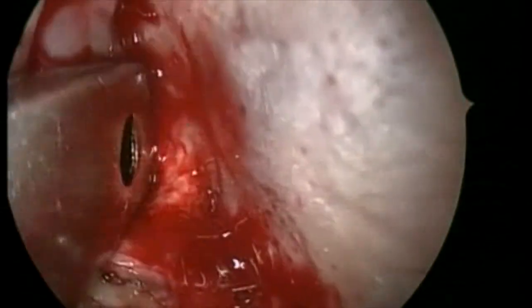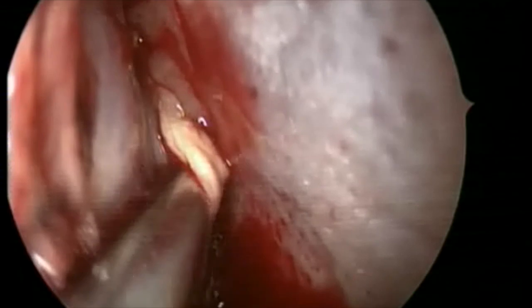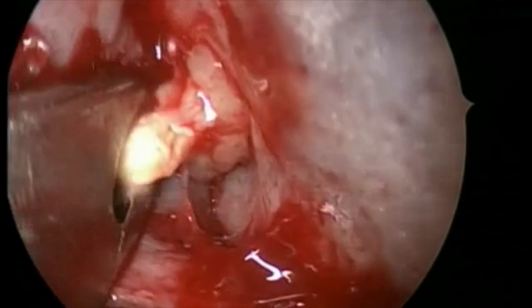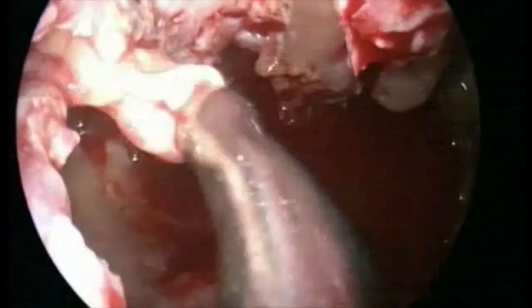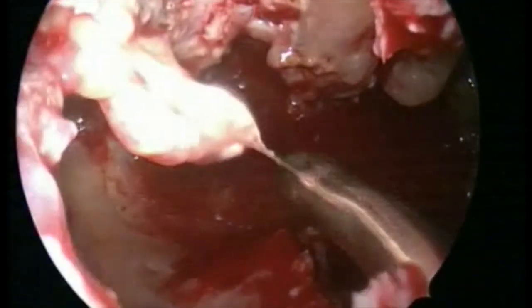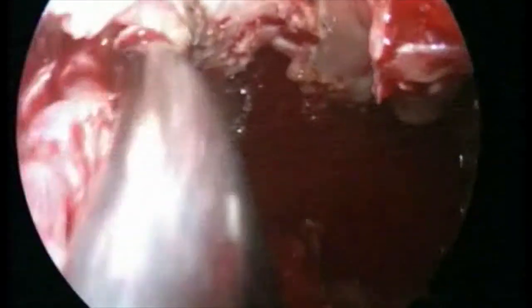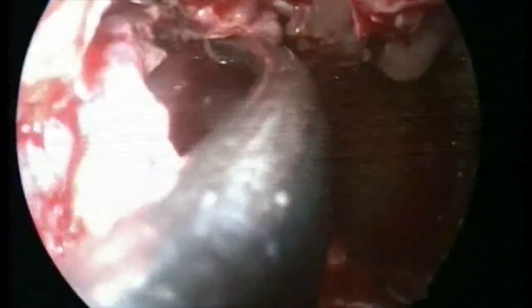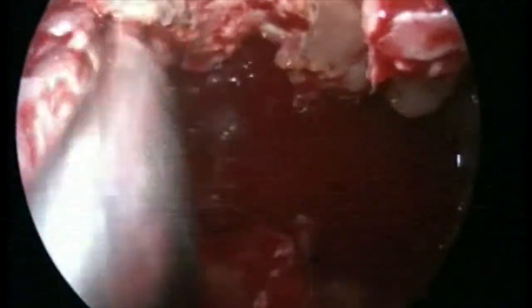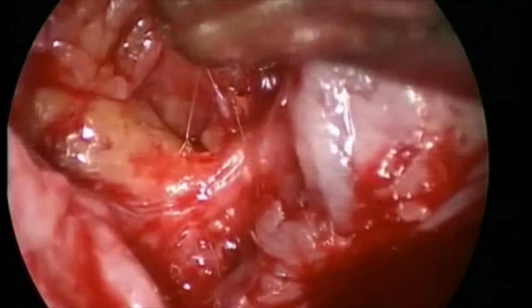This is the right side Denker's approach. You are seeing that the infraorbital nerve is completely involved, and in fact the fungal pus has tracked to the anterior aspect of maxilla. We removed the pus and now we have done the Denker's approach. We are removing the infraorbital nerve and following the fungus into the orbit. That's the right maxillary sinus, that's the infraorbital nerve and fungus being removed.